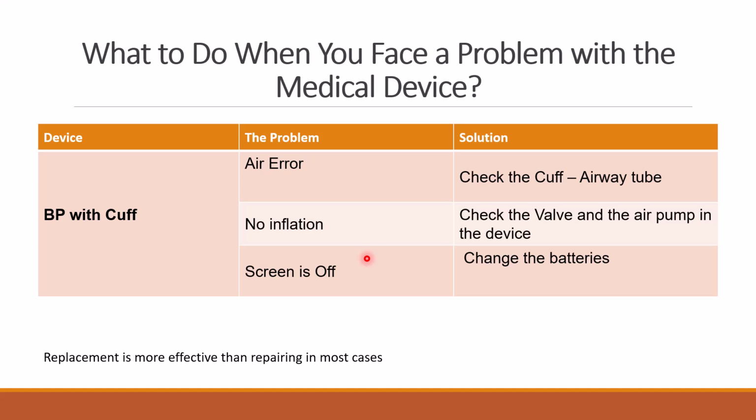Okay, screen is off. In most cases the device is not working, you can change the batteries and everything will be okay. As I told you, replacement is more effective than repairing in most cases, especially for the small hand-sized devices. Okay, especially for the Chinese brand.